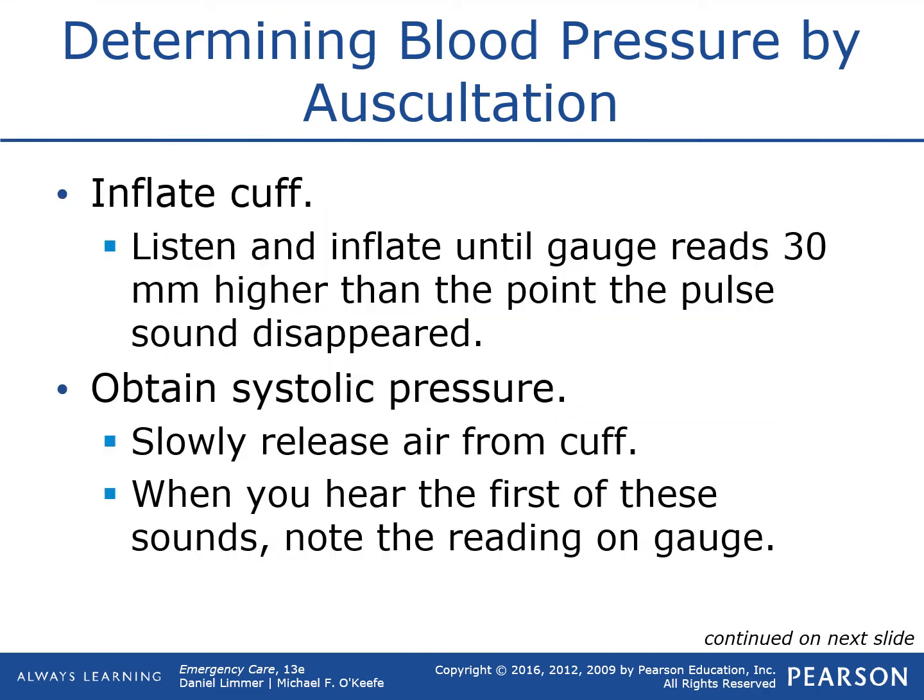So you want to inflate your cuff. Generally, when I'm teaching people how to do blood pressures, I tell you to inflate your cuff to about 100 millimeters of mercury and stop there for a second. The reason is that the majority of our patients, not all of them, will have a systolic and diastolic range that covers the 100 mark. That means your systolic should be above 100, and your diastolic should be below 100. It shouldn't be above for most of our patients.